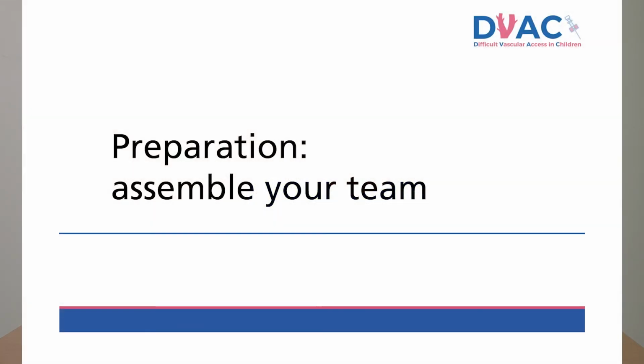Preparation, assemble your team. Although the idea of assembling a team for cannulation might sound dramatic for what might be considered a straightforward procedure, help is key. I would never approach cannulation in a child, particularly a younger one, without an additional set of hands or a few sets of hands. As a bare minimum, you need someone to hold the child, which is usually the parent, someone else to hold the planned insertion site and help secure the cannula. You should consider who else is around you and who else can help make the procedure less stressful for the child. And if you're lucky enough to have a play therapist in your department, definitely get them involved and on board.